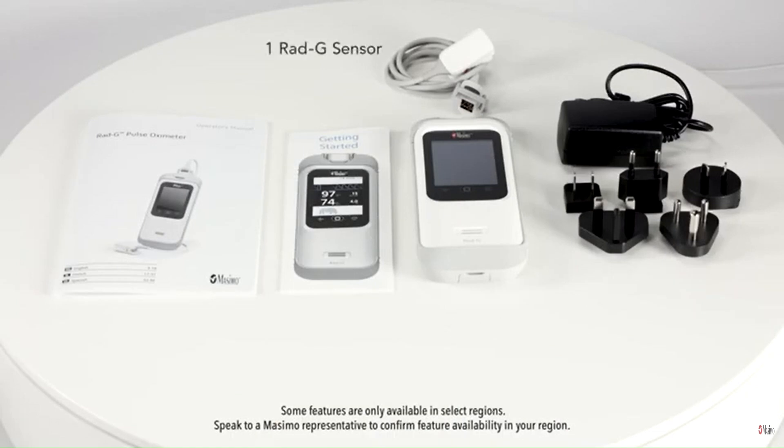one RadG sensor, one charging cable, plug adapters, and a quick reference guide that walks you through the basic operations and setup of the device.